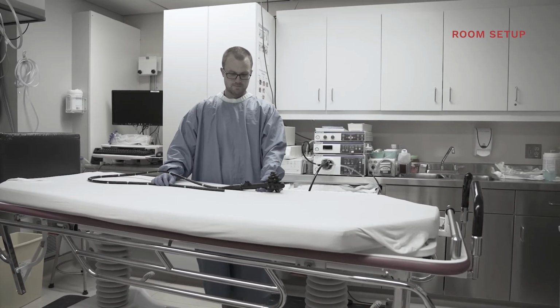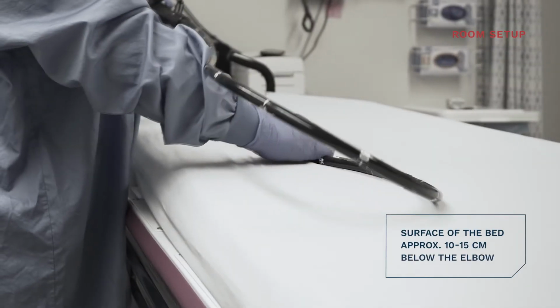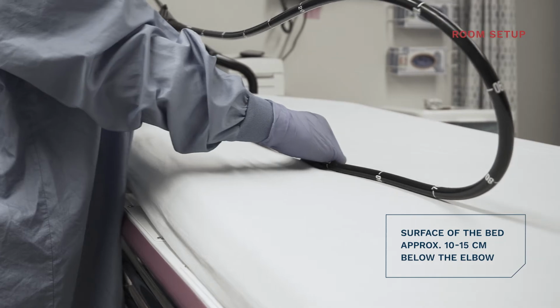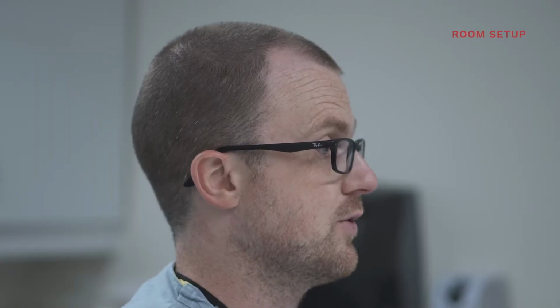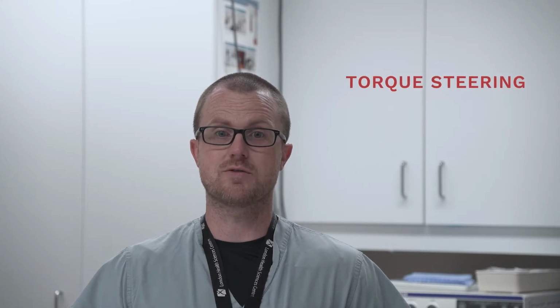The height will vary based on the height of the endoscopist, but as a general rule, the surface of the bed should be approximately 10 to 15 centimeters below the elbow to allow a comfortable resting angle for the forearm during the procedure. The preferred method of scope advancement for avoiding and reducing loops is torque steering.